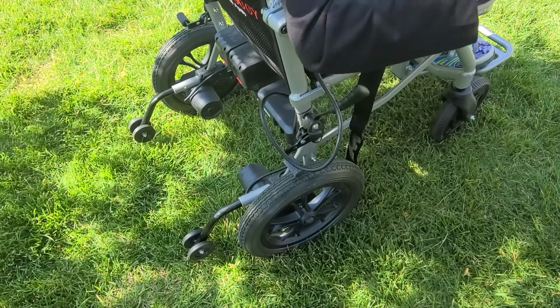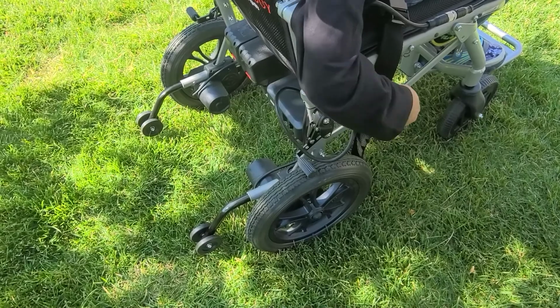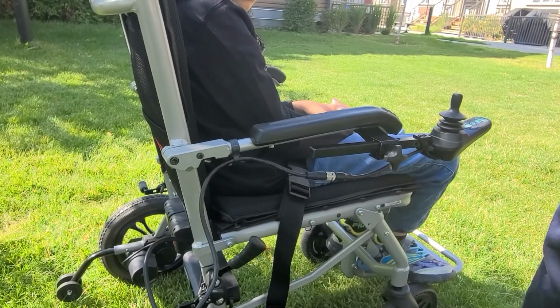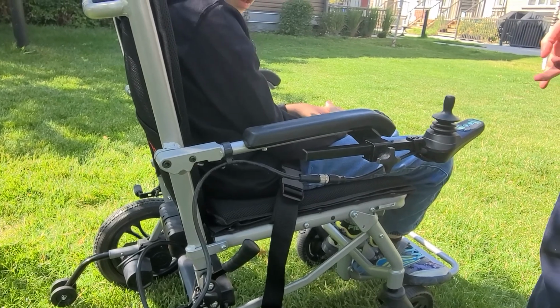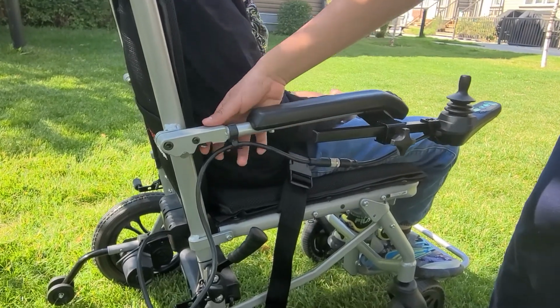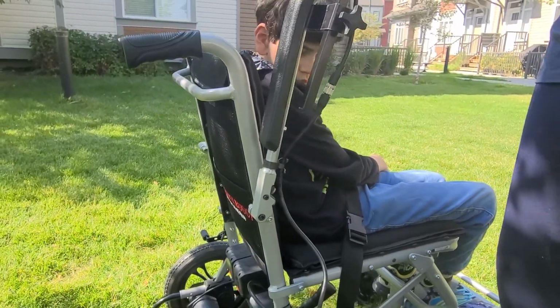Here are the brakes. You could stop anytime. When you're folding the wheelchair, you're supposed to lift the arms up. To lift the arms up, you push this button, and the whole arm set goes up.